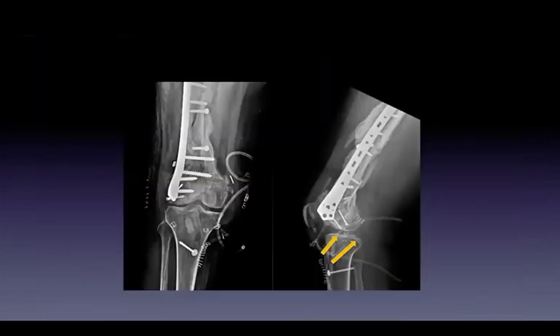So this was the X-ray post-operatively. So you can see the tibial tunnel, the ACL and PCL tibial tunnels, and also the femoral tunnels. So they escaped the implants and got a good position. So here it is very important. You can use the C-arm during your intra-op. One should not shy away from having a C-arm during this procedure in your initial phase.